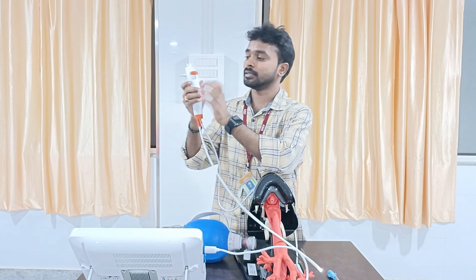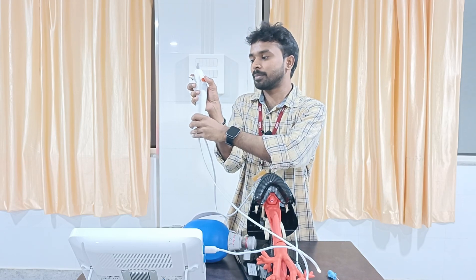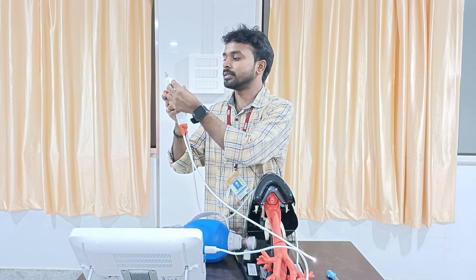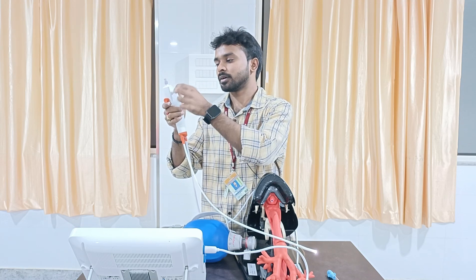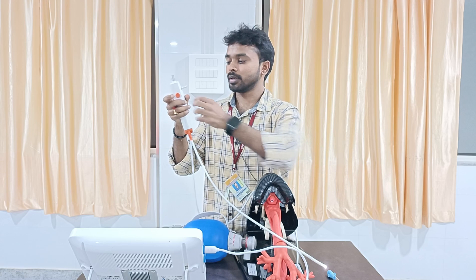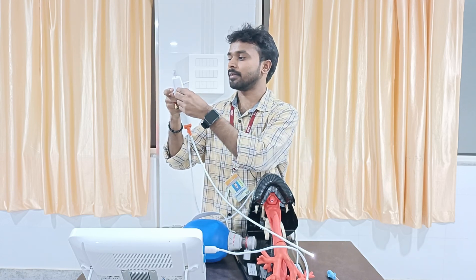The next thing is the control lever, where I can move it up and down so that visualization will be very easy. This is the suction port, where we can connect the suction catheter and suck out the secretions. Then this is the suction button — we can press it down and up so that we can clear the secretions and clear the airway.